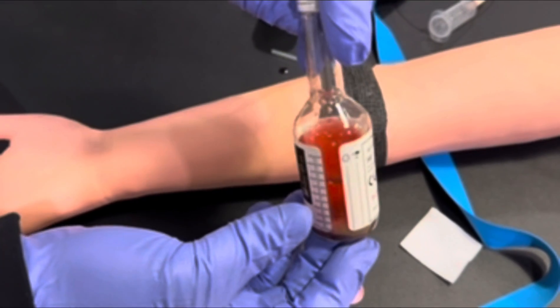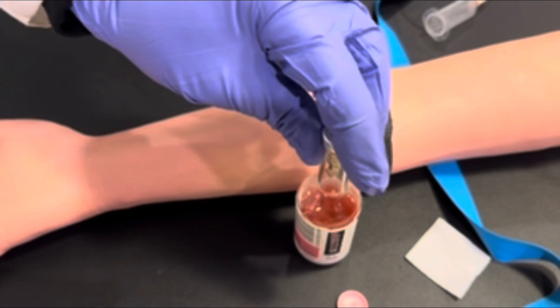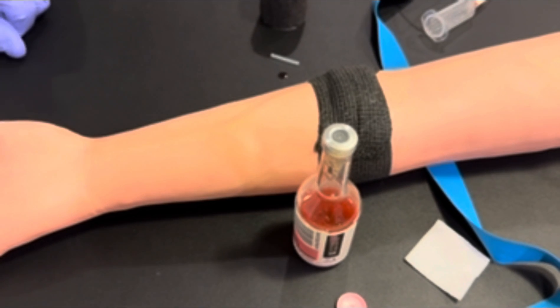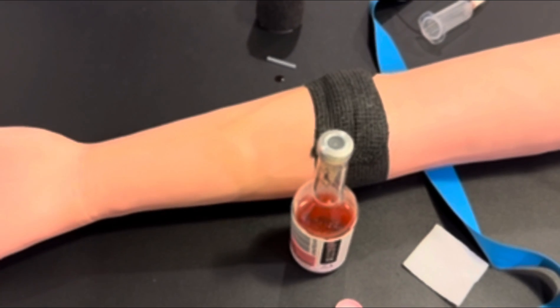Make sure that you have collected enough blood in your blood culture bottle. Invert the bottle a couple of times in preparation for patient identification labeling and sent to microbiology. Thank you for today's procedure.